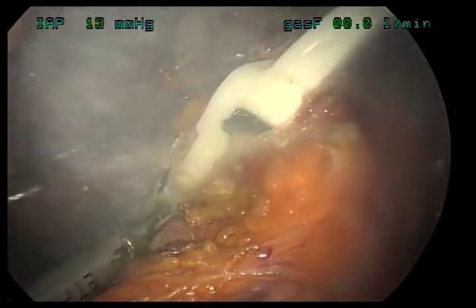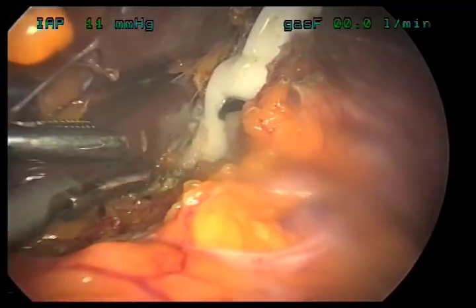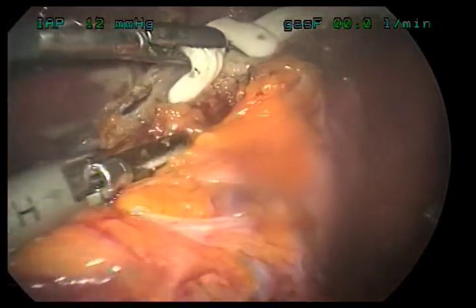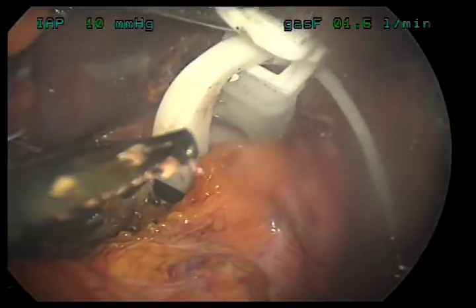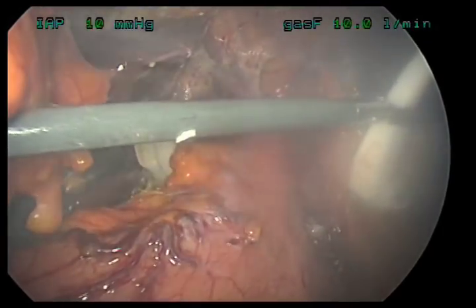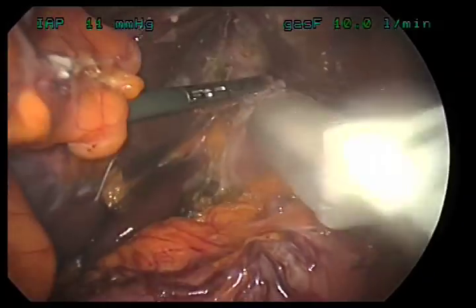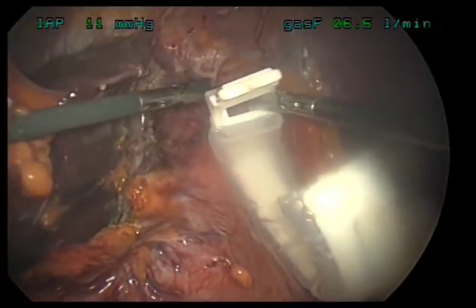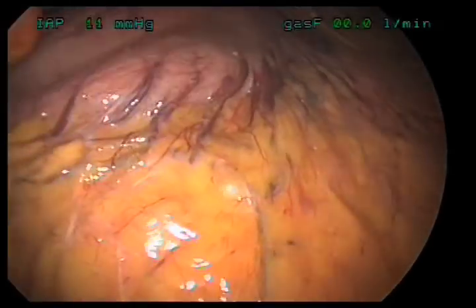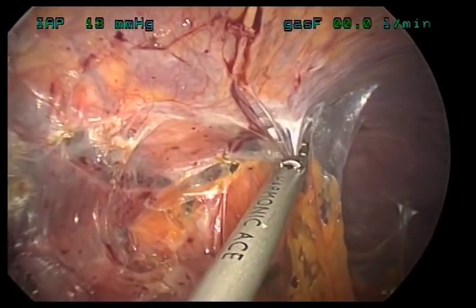Now we're cutting down on the lap band and removing scar tissue from around it. We're grasping the buckle of the lap band and unbuckling it. We're going to remove it in pieces — here's another piece of the lap band being removed from the abdominal cavity. Now that we've taken down the lap band, we can begin to take down the scar tissue from the old surgeries to the stomach.